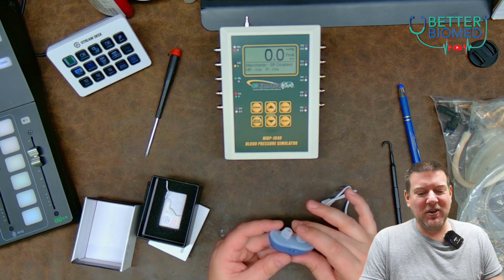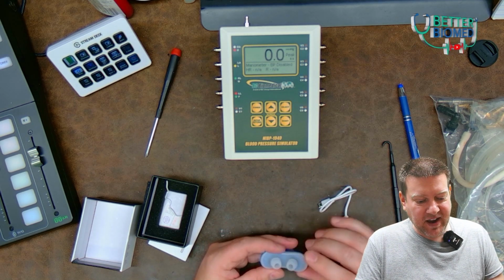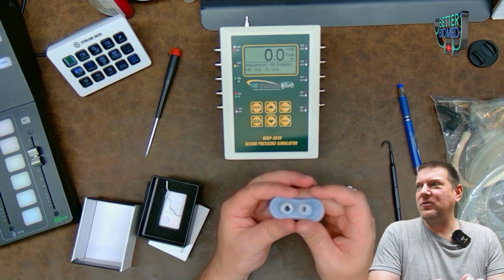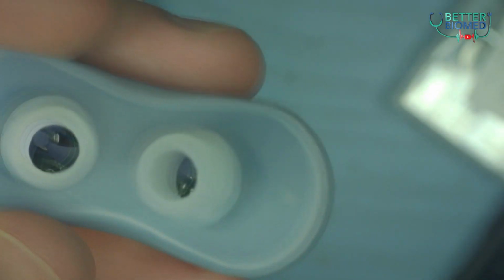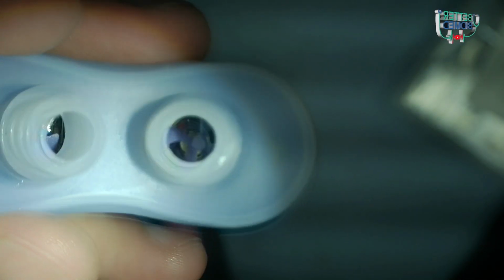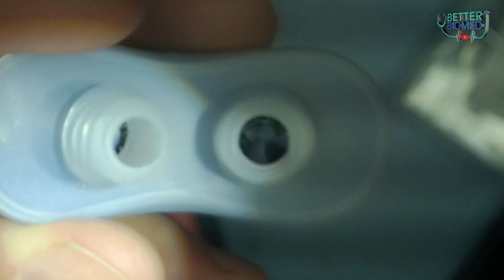Okay, guys. Well, I'll tell you what we're going to do. We can take a measurement now. Oh, I can see it's just two tiny little fans. Man, let's switch that over. Can I do the microscope? There we go. Okay. So you can see that there's four blade fans, and there's two of them. We are so going to tear this apart. Take a look at that. There's one little fan. There's another one over there.